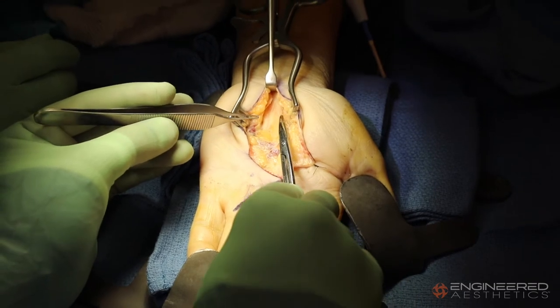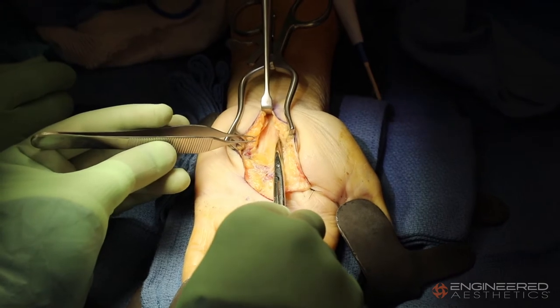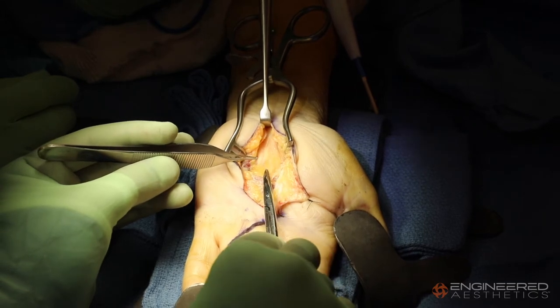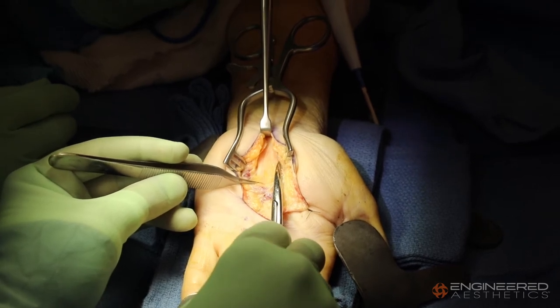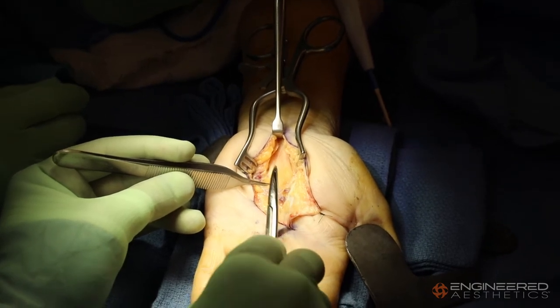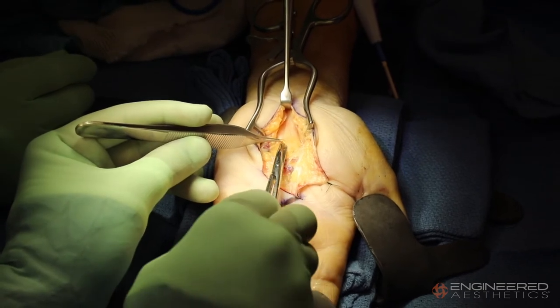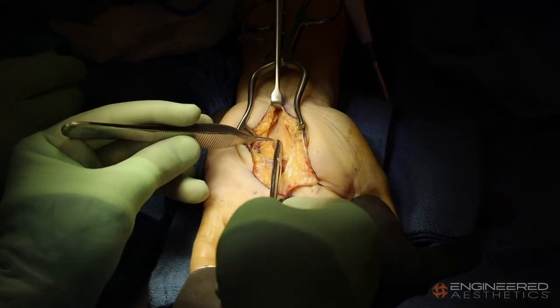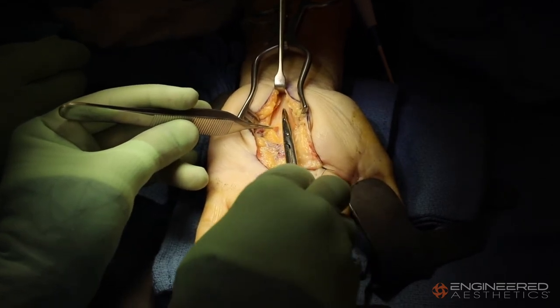I've exposed the carpal tunnel. This is the median nerve. What's special in her case is the fact that she's already had a carpal tunnel release performed once before, which is why we elected to do this through an open technique. I cannot do an endoscopic carpal tunnel release if the patient has already had one done before because of the scar tissue that develops around the nerve itself. You can see that the nerve is caked in there, and I'm going to have to slowly separate it from the surrounding tissue — a very gentle, delicate dissection. This is all the scar tissue building up around the nerve itself.